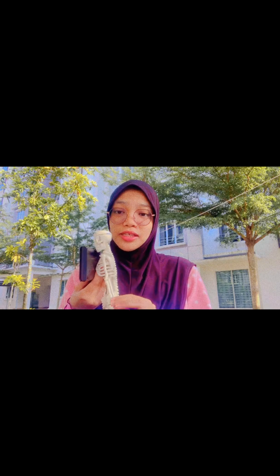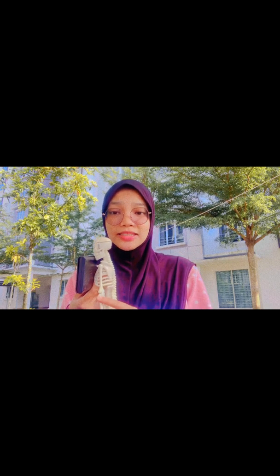For the PA ribs projection, the patient can be in upright or in recumbent position. For the upright position, first of all, we must ask the patient to face towards the erect bucky. Then the hands of the patient are on the lower hips, palms out, and elbows partially flexed. Make sure the chin is raised and align the mid-sagittal plane perpendicular to the image receptor, or the IR.